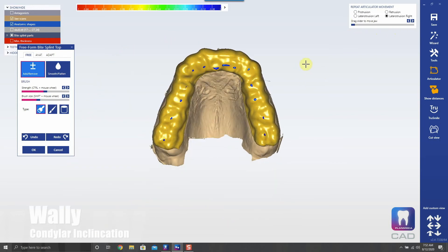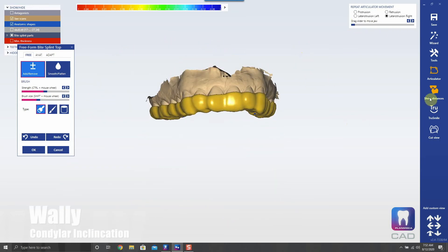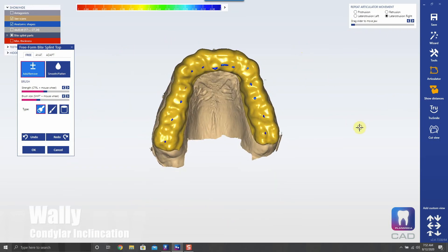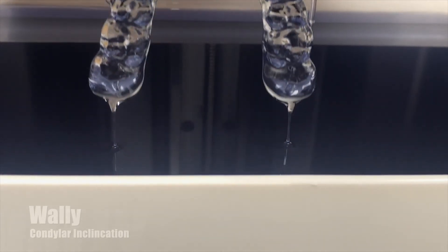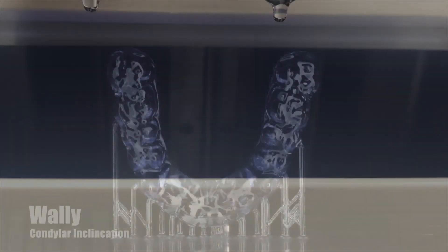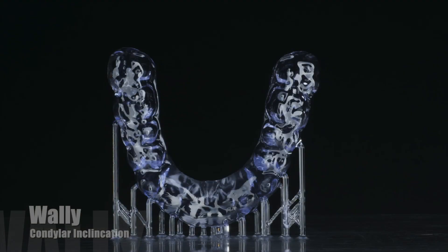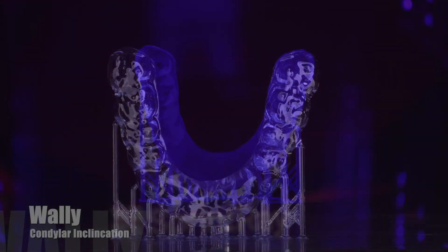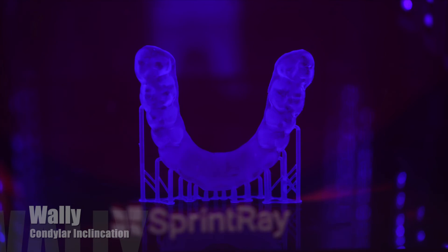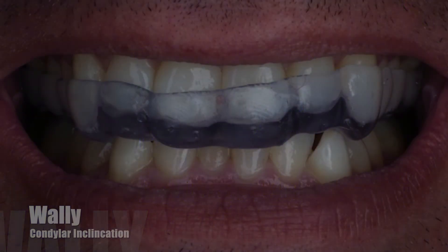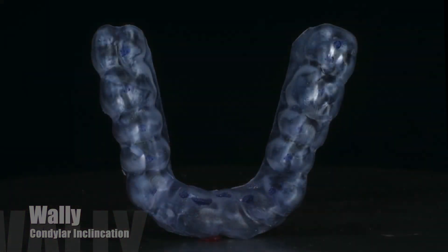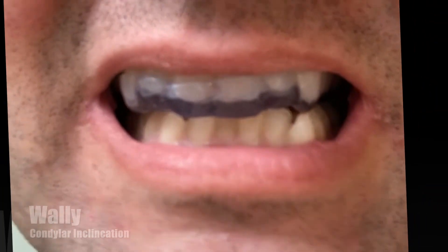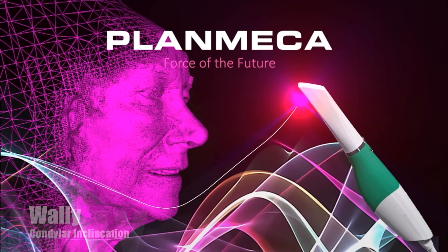So let's go ahead and 3D print this thing out of Keystone Soft. There's the final printed product going into the cure box, and there it is fitting in the patient's mouth. There are the occlusal marks exactly where we had them in the software, and here's the patient going through excursive movements.